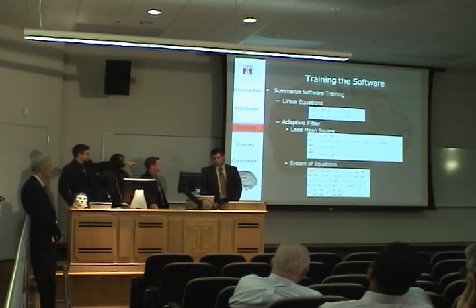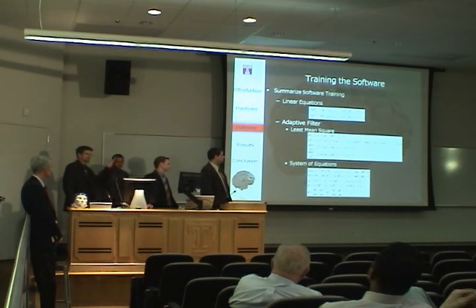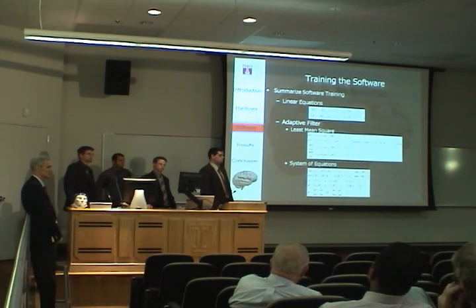You make substitutions for D, F, C, E, G, A, E, and you end up being left with a relatively simple procedure. And then the weights get fed back, and the weights that are fed back are used the next time around. So the next time it processes the data, those weights will affect the final position.